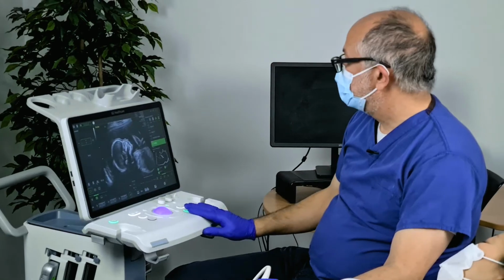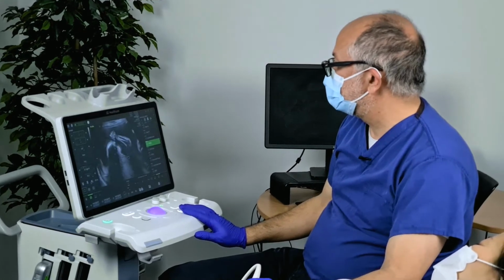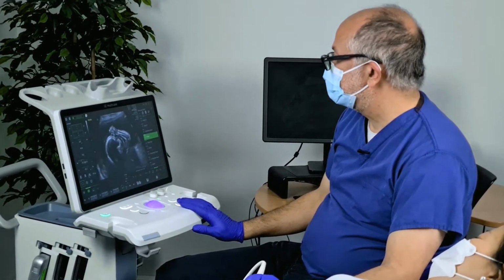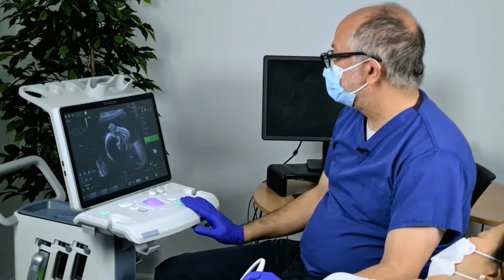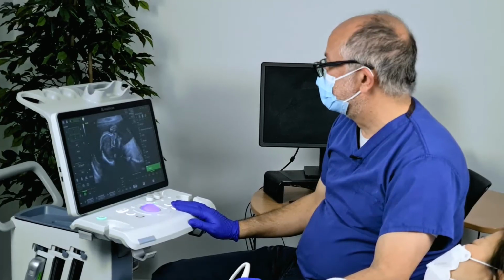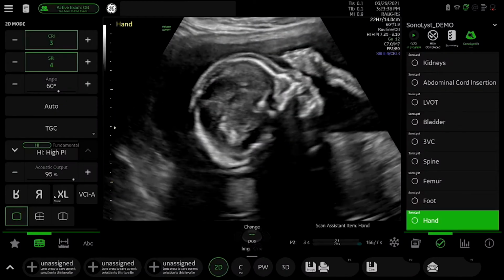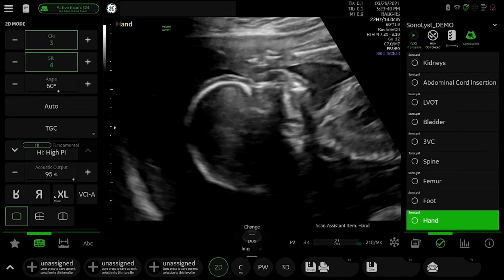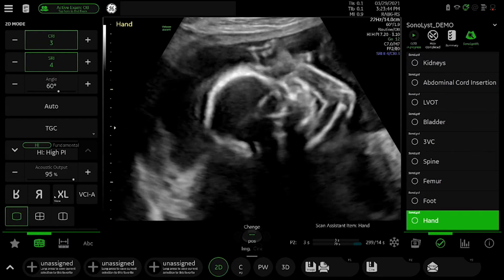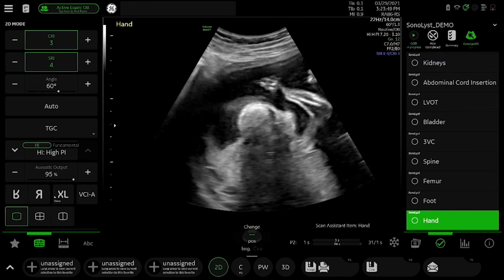Now I can try and on purpose make a mistake, or maybe the baby puts the hand in front of the face, which is kind of helpful. So what I'm doing here is saying, okay, not a very good profile. In fact, it's saying, no, you've seen the hand. That's funny, which is true. I haven't seen the hand there. But let me try and purposely make the image of the face not perfect. Maybe the easiest is by not magnifying sufficiently.